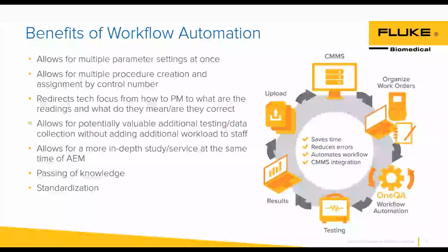And with this, you can standardize your test based on the model specific. So if you're using a defibrillator that's standardized across the hospital, there might be certain models or features that are on one device that aren't on the other. Take, for instance, in the ICU, there might be a defibrillator that has all the parameters, and then in other areas of the hospital, it might only have one or two patient monitor parameters. So being able to standardize to make sure you're doing the right tests on the right device, that's a feature here.